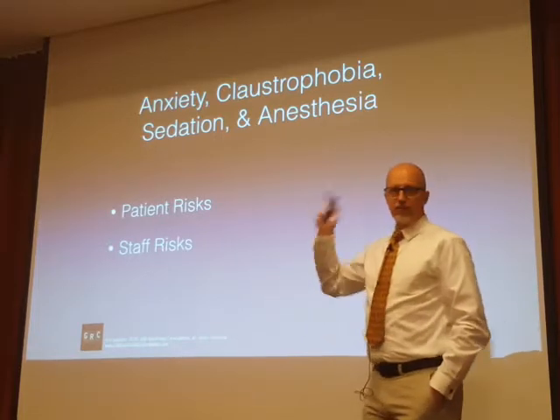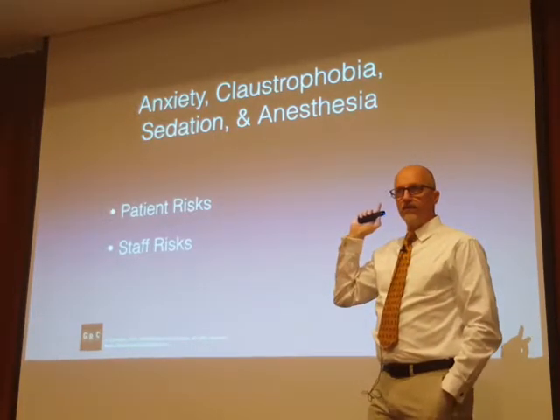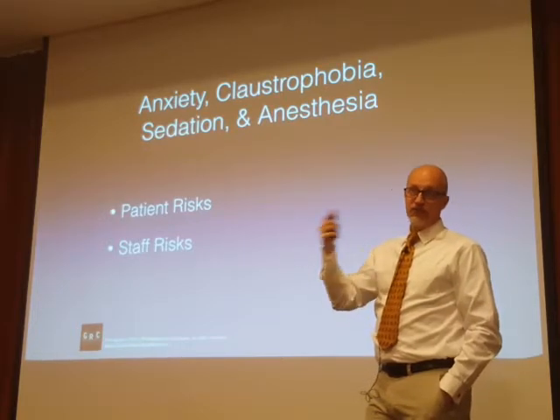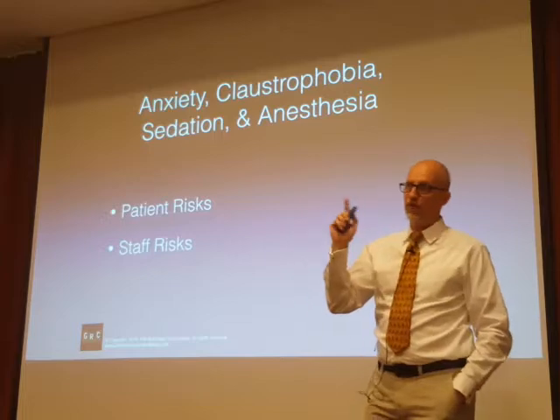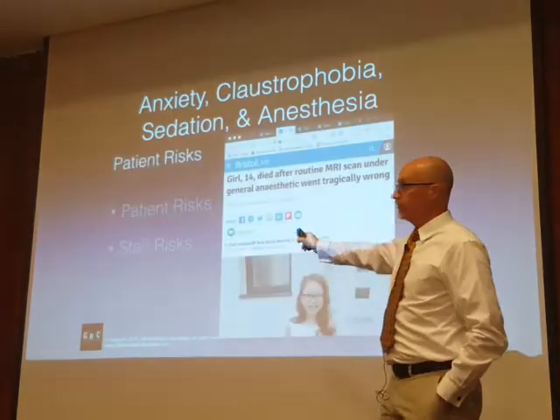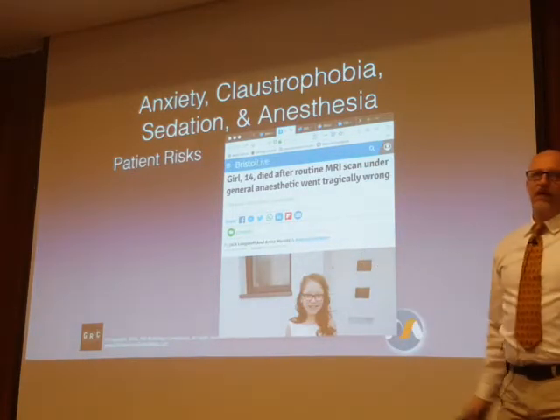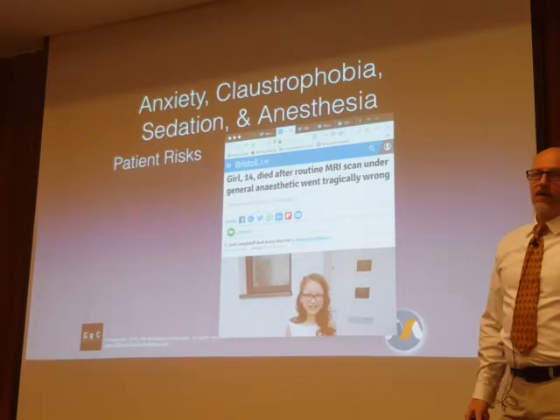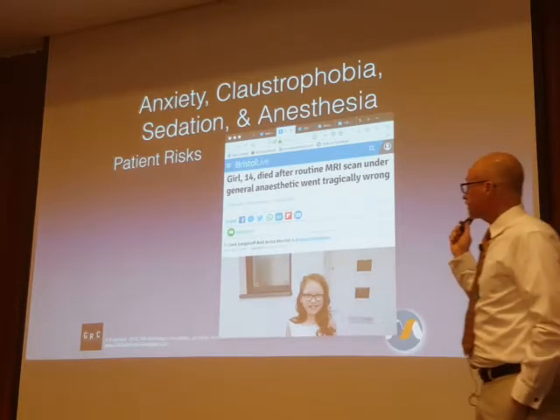So when we start talking about anesthesia care, the equipment and the personnel that get brought to MR, we're really talking about risks to 2 different populations. We're talking about risks to patients. This is a fatality that occurred in MR, a general anesthesia patient.